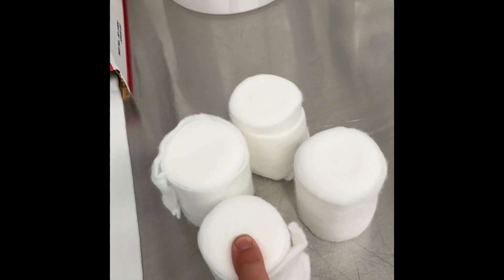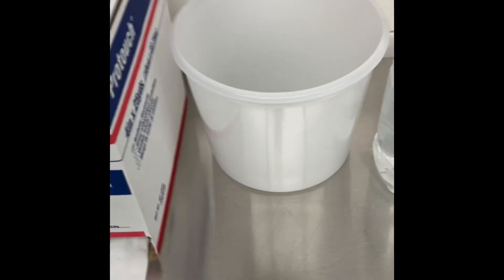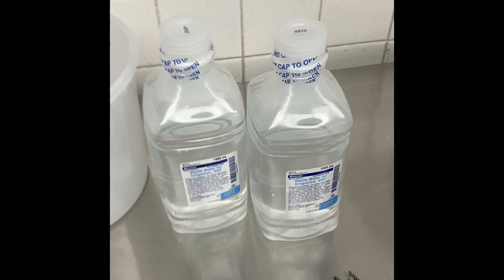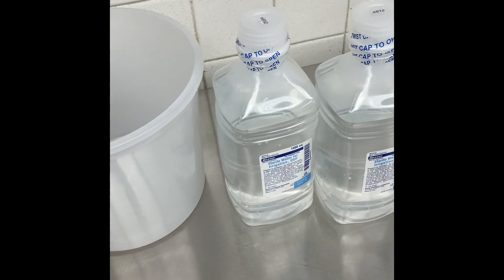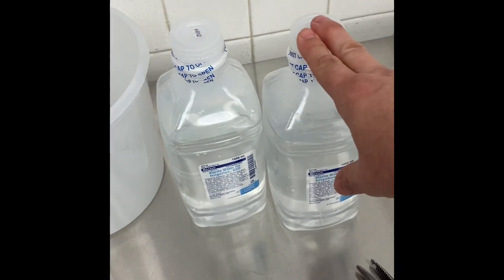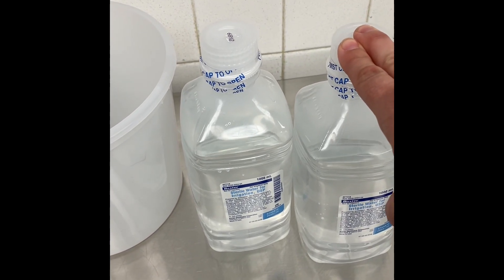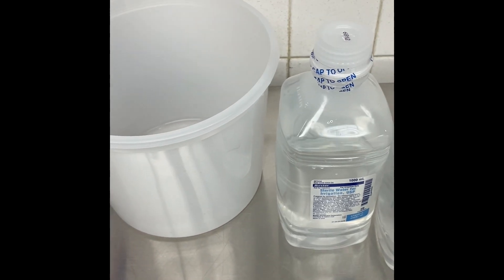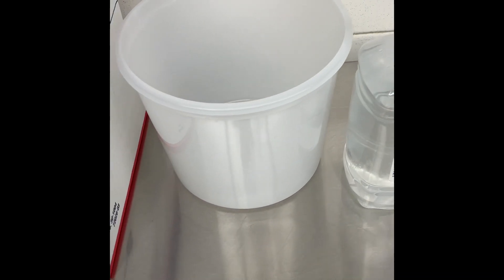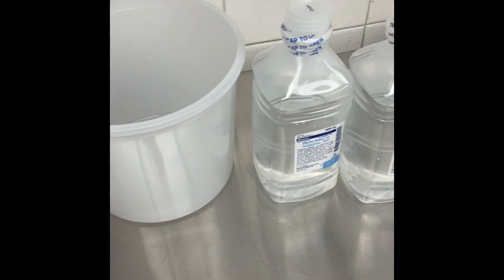I got four rolls of three-inch soft roll, and I have more if we need it. You need a large bucket and some water — it doesn't have to be sterile, but I use sterile water — and you want to make sure that it's room temperature. Sometimes we do use warm water to make the cast firm up faster, but you don't want to do that on spicas because it's time-consuming to put them on and you don't want to be rushed because it's hardening too fast.